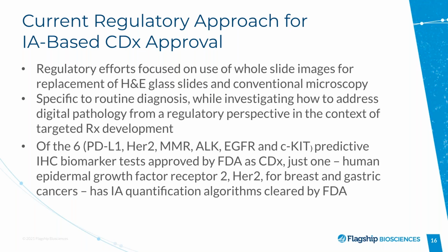While it's true that this is a complex thing to do, the thing to keep in mind is that generating a digital solution for this marker not only provides you with better accuracy and better precision, for the reasons we discussed earlier, and potentially also, by the way, with better ease logistically in performing the assay, but it's bound to also give you an additional large amount of data that simply could not be obtained by traditional wet immunohistochemistry.